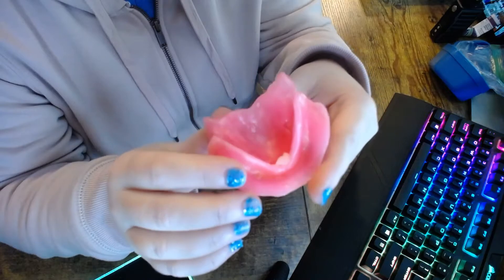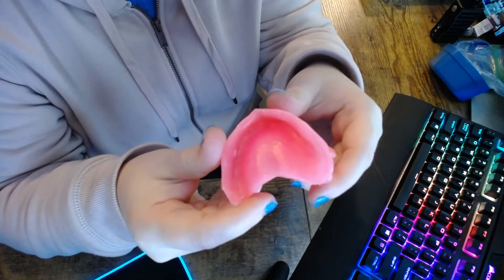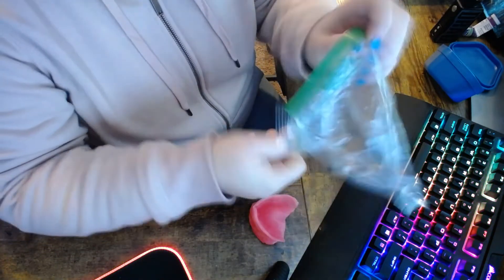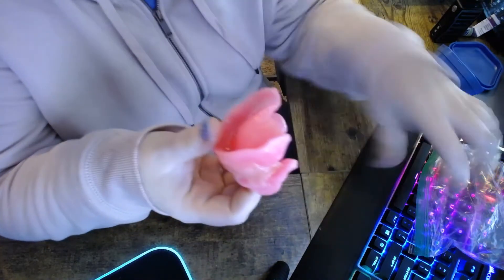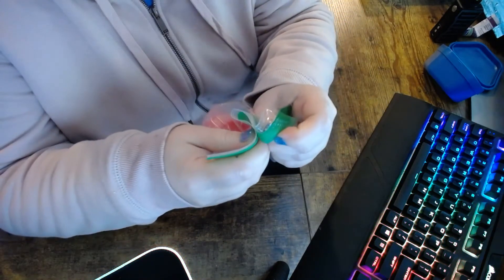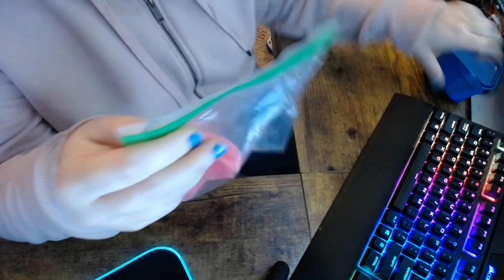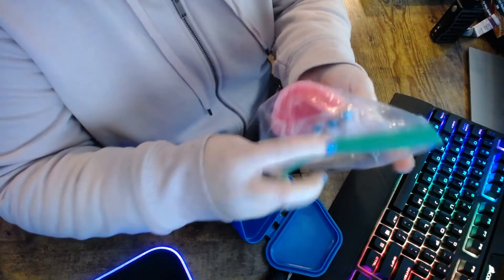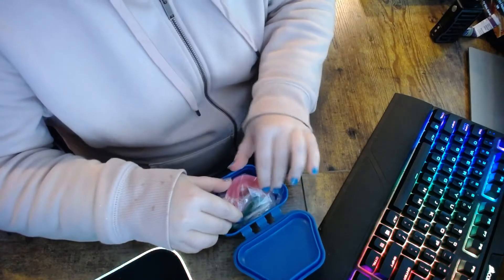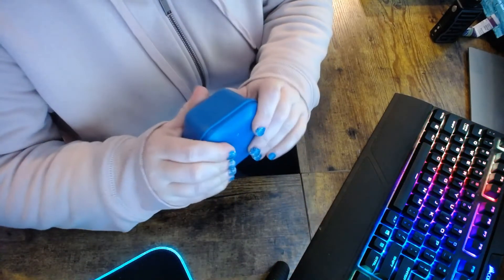The lower and the upper — this is all done. So I'm going to go rinse this off. I've just washed this off and made sure that it was nice and clean. I'm going to put this in a plastic bag to give it a little cushioning while it's in the denture tray that I'm getting ready to send back. There's Jamie's denture tray. I'll go ahead and put this in here just like that, close it up, and voila — I'm ready to send it back.